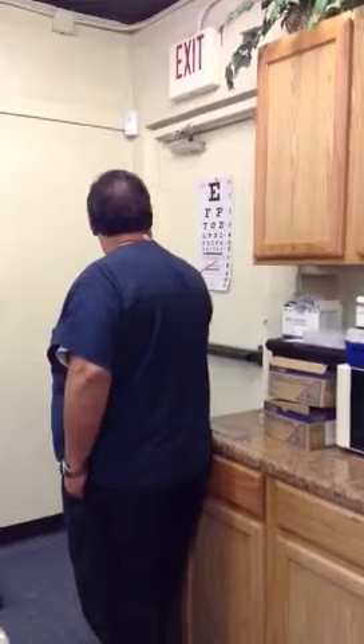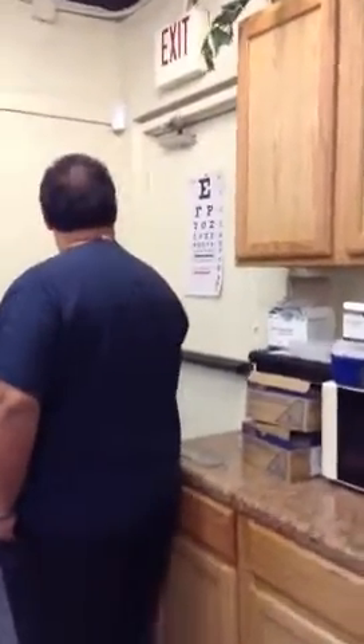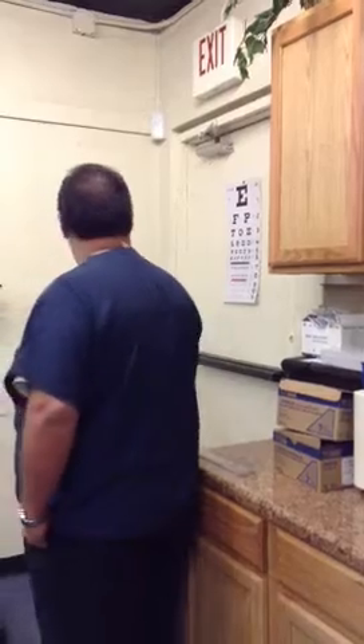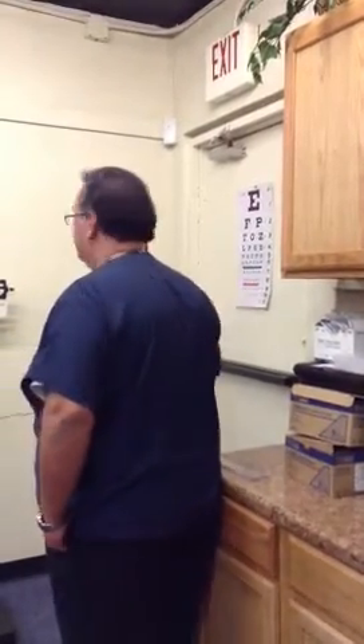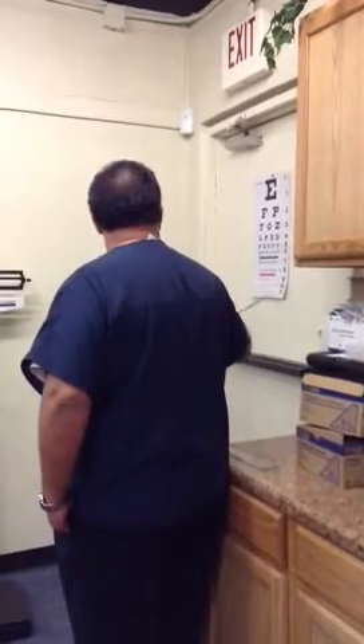Now we're going to go to line seven, from here over to here. F-E-L-O-P-Z-E. How about line eight, going backwards? C-E-T-O-P. Do the best you can. T-E-E-B. Very good. And line nine, let's go forward. L-E-T-O-D-P-C-T. Very good. How about line ten, going backwards? O-E-C-T-L-P-D-E-F. How about line eleven, going forward? I can not read that. Okay, very good.